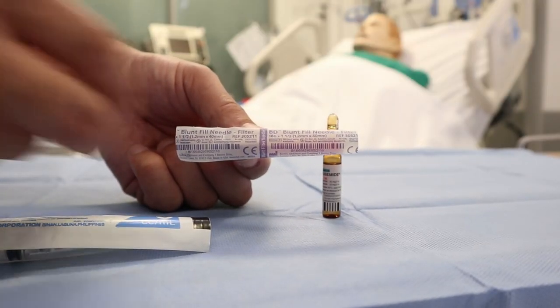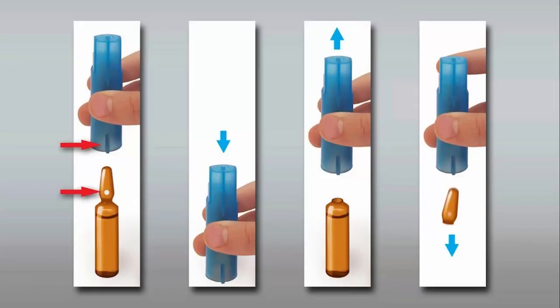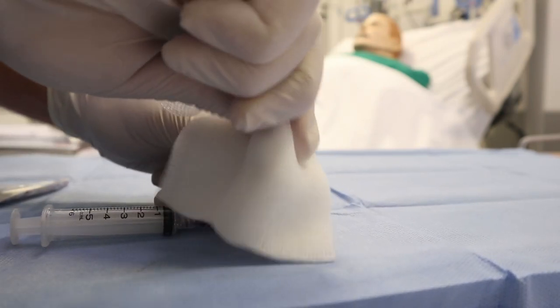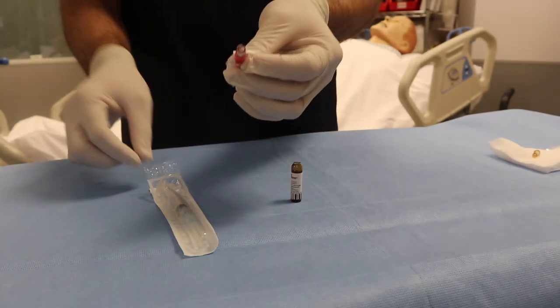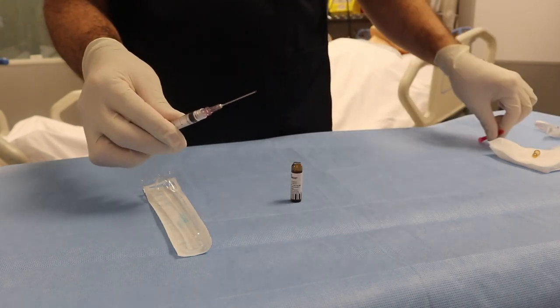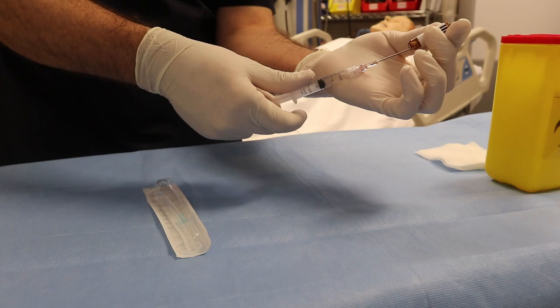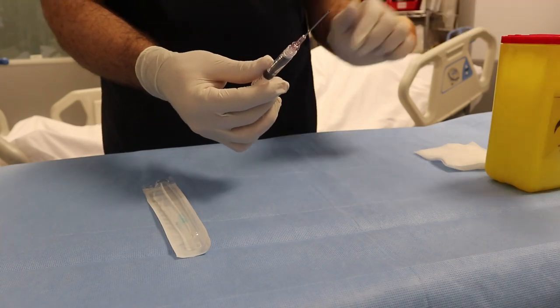Tap the top to move the fluid from the neck of the ampule. Place a sterile gauze pad or disposable ampule breaker around the neck of the ampule. Snap the neck of the ampule quickly and firmly outward, away from the hands. You can do it in this way, or this way.